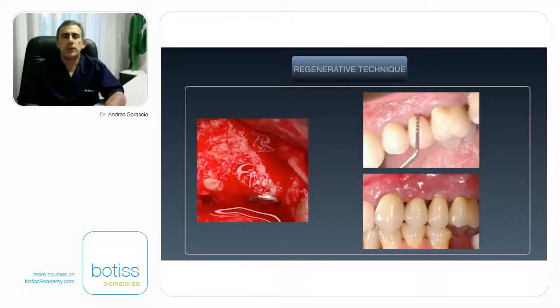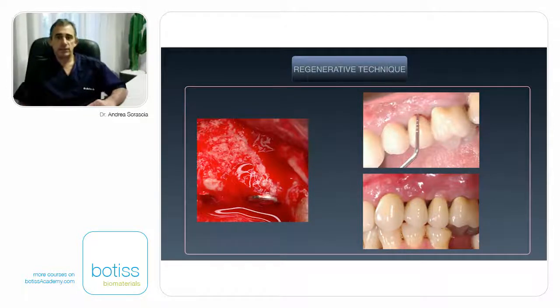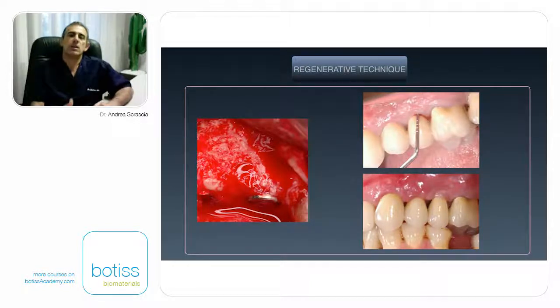During surgical re-entry to reinsert the crowns, I was gladly observing the positive results that you can see in the left pictures. Although I know this is not a reosseointegrative process, but only an ossification process around the implant.